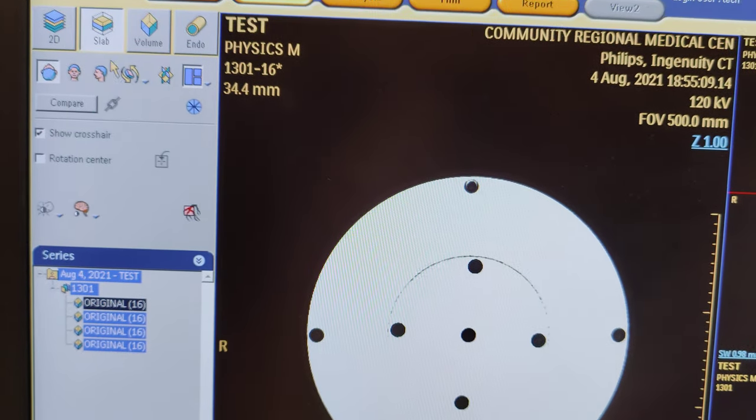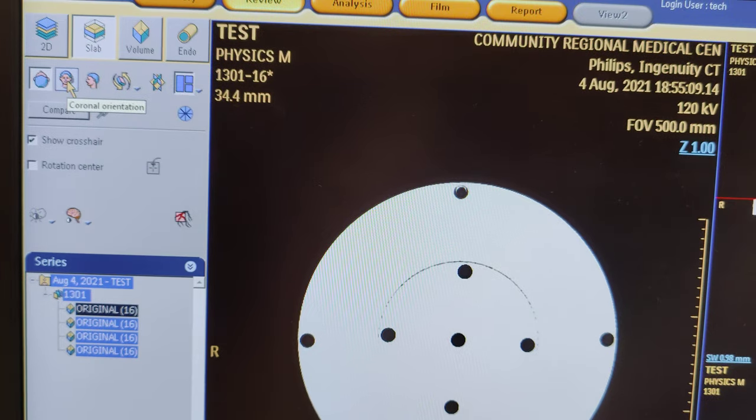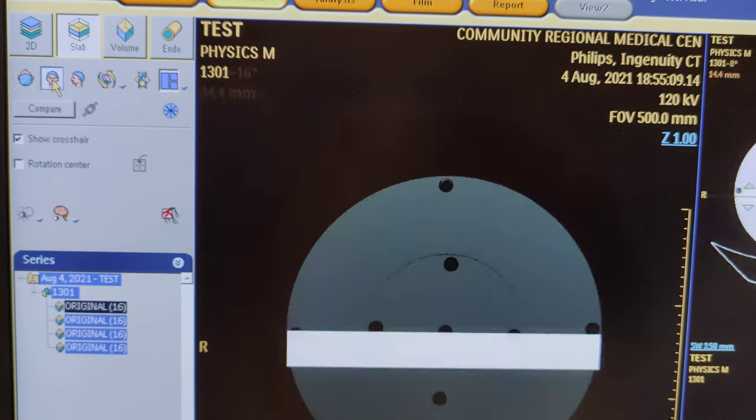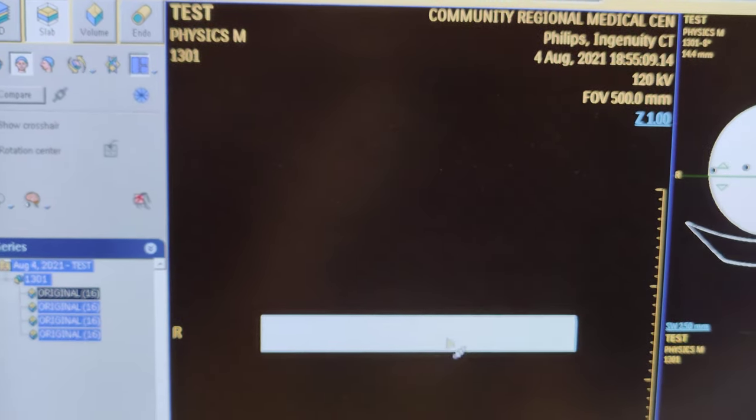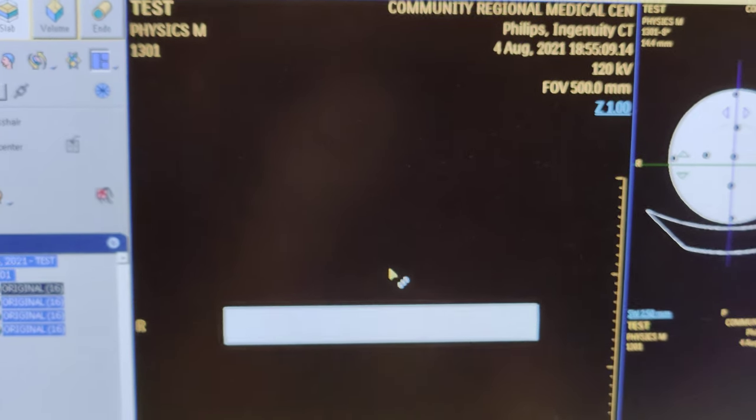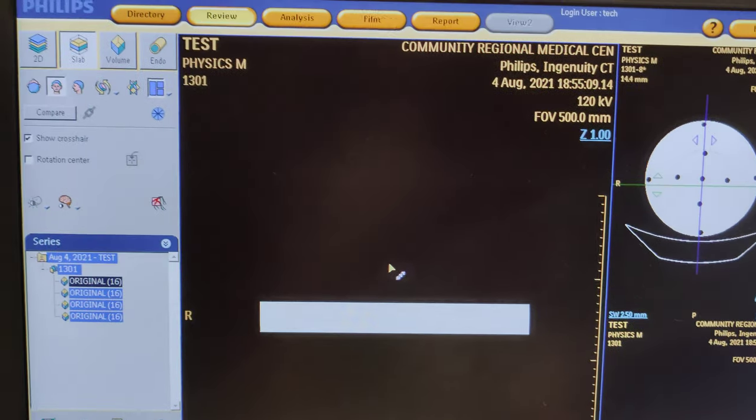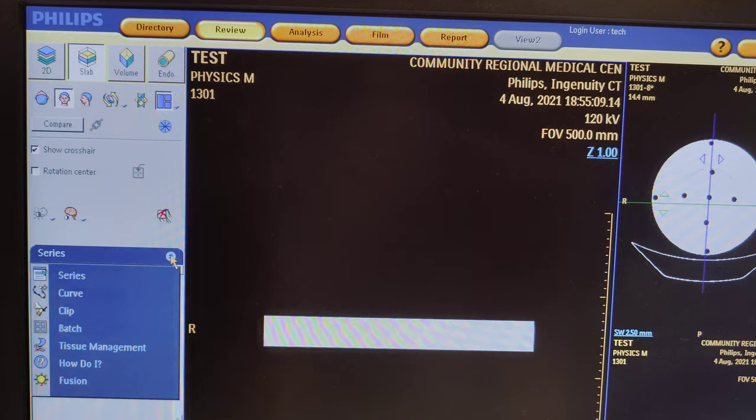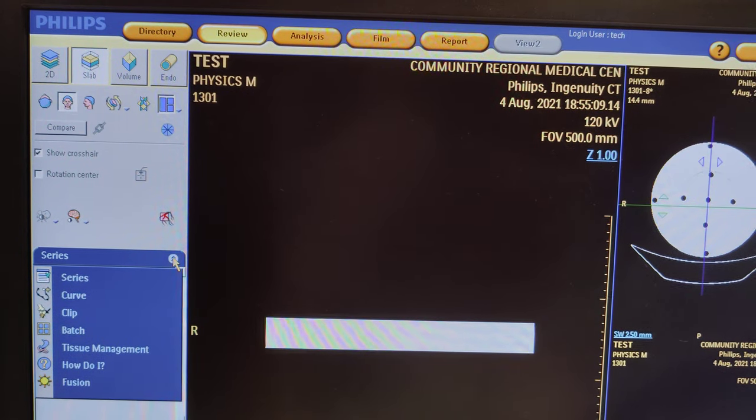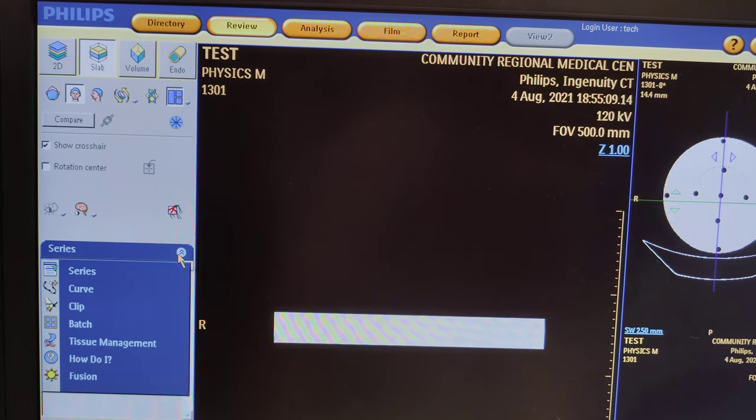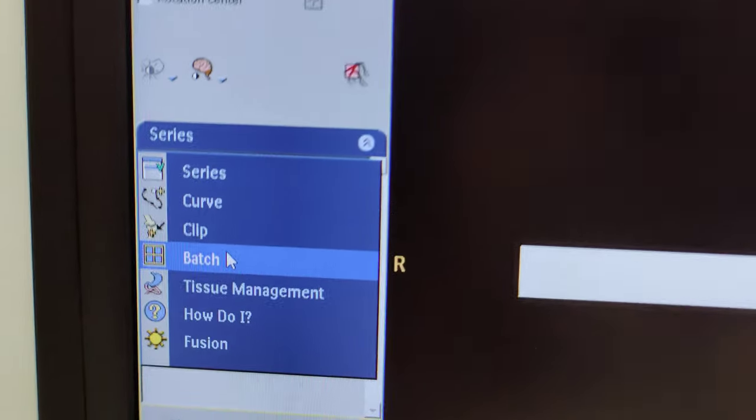thing you want to do is make your patient face you in a coronal view. After that, you're going to click here, the chevron button, and come down to batch.